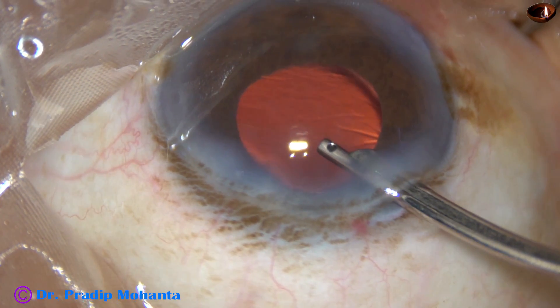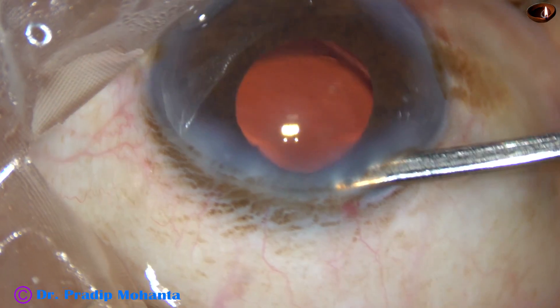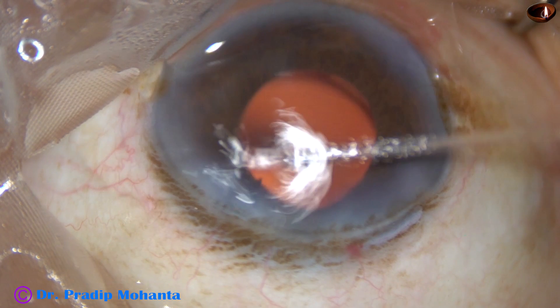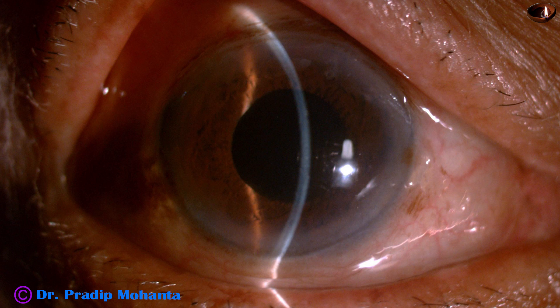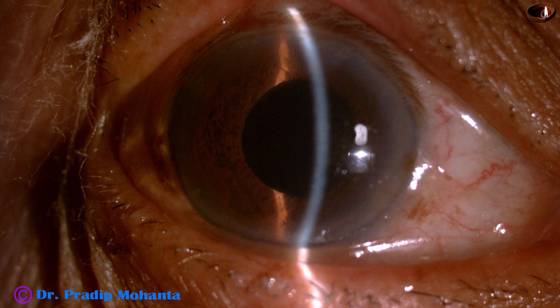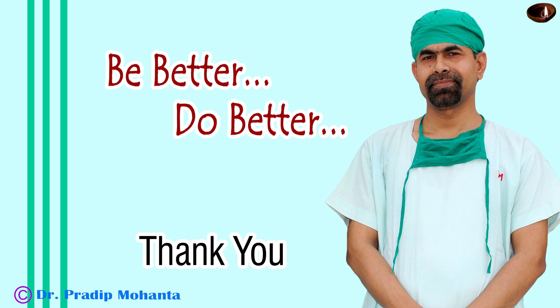The case is done. The anterior chamber is nicely formed and the case is concluded. These are the post-op pictures after 4 hours — see the cornea is clear, the anterior chamber is quiet, and the pupil is round. I am very happy, and the patient is also very, very happy. So be encouraged to take on challenging cases. Thank you very much for your attention.